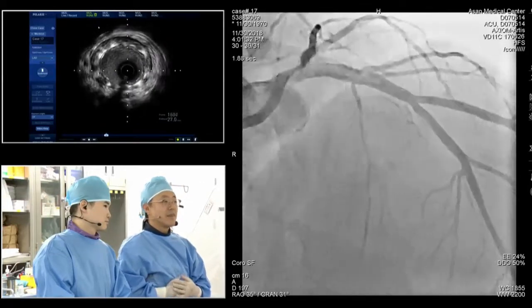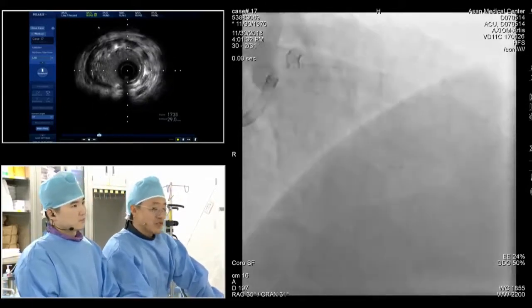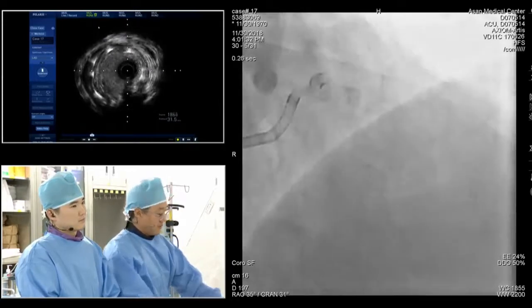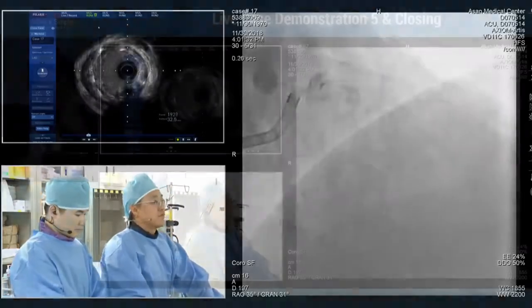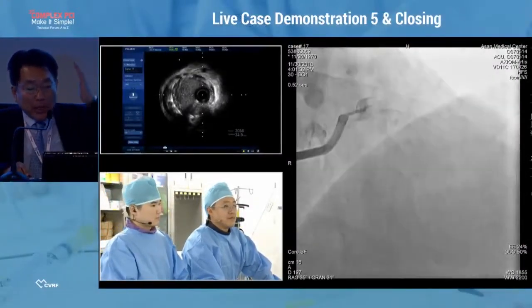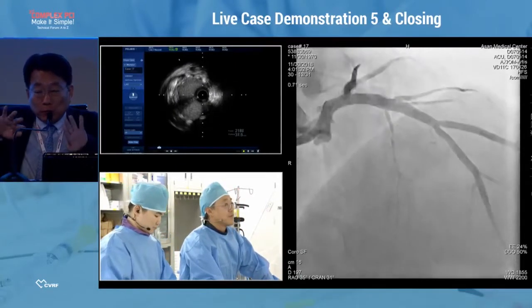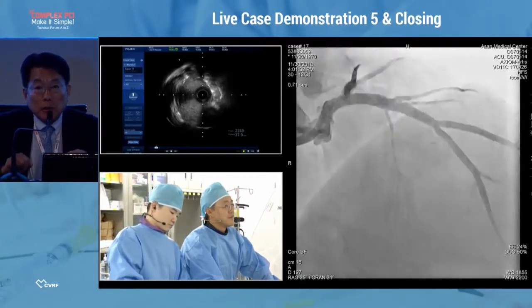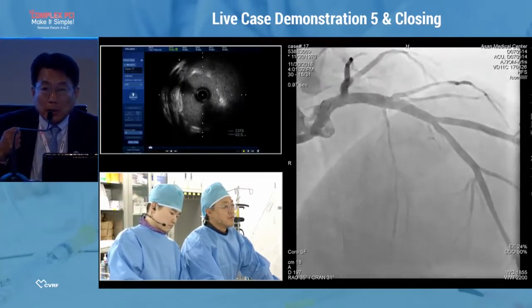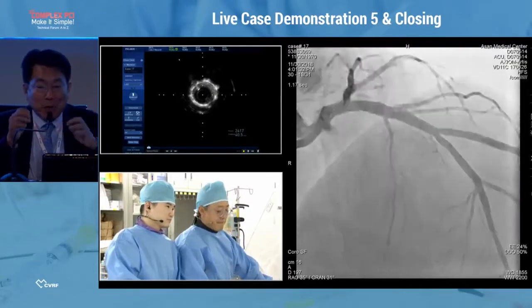Okay, so you mean you worry about the two balloons in the main, too much toxin, overdose? I think it's not too much concern about that. The meaning is, in the balloon, paclitaxel is usually at very high concentration. The reason is in order to diffuse to the vessel wall. And to be honest, I think the high concentrations may be better.